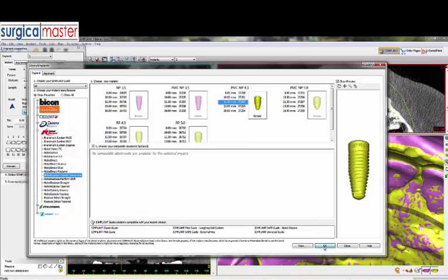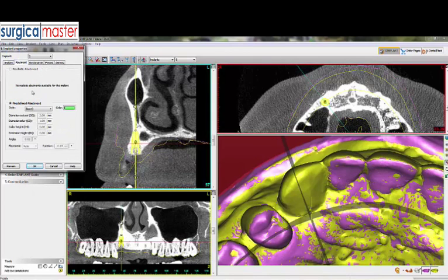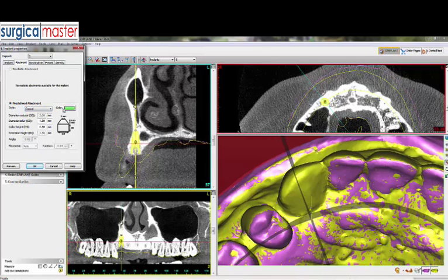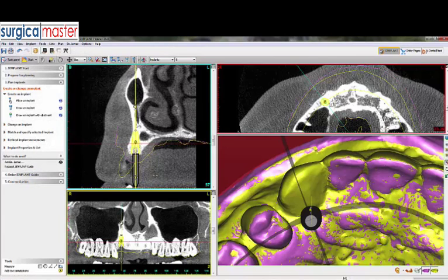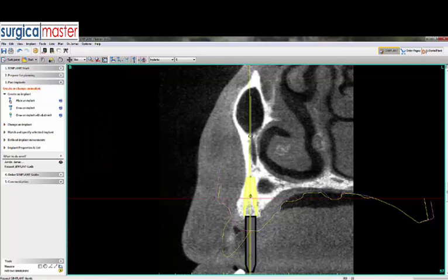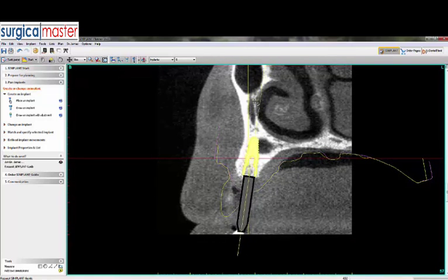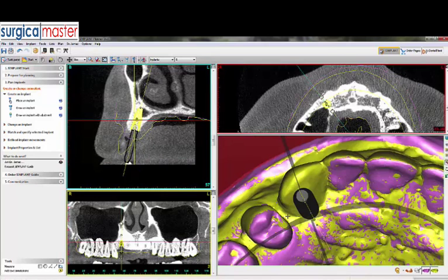I'm also going to connect a conical abutment — not a restorative abutment in the normal sense — colored black, with a 3.5 diameter and a length of 15 millimeters. This only allows me to see the trajectory of the implant. Any way that I move the implant, it will move with this abutment, and we'll see what restorative changes happen when I do that.